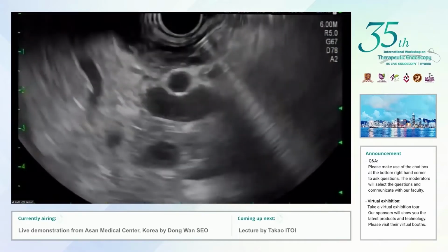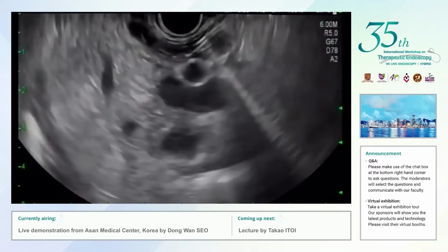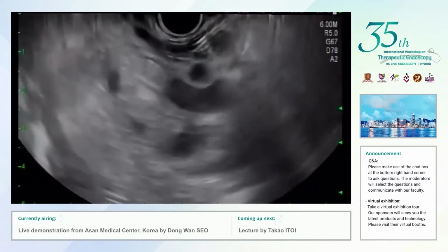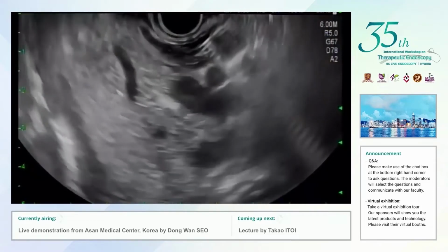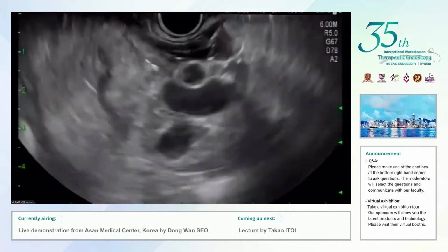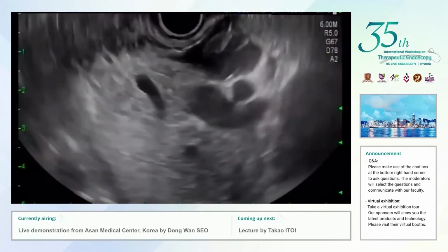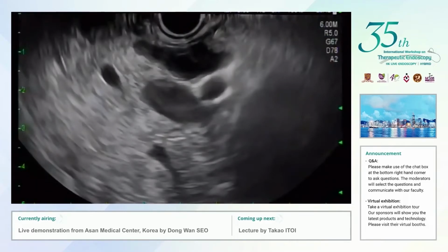It is because in the blood, there is some amount of amylase, but it's not that high like 700, 800 unless the patient has pancreatitis. And the CA level, I don't think CA level will change much, even though there is some blood contamination. Because my lab sometimes comments that my sample was bloody, and then the machine cannot extract the fluid for analysis. So I worry that blood actually may bother the analysis.